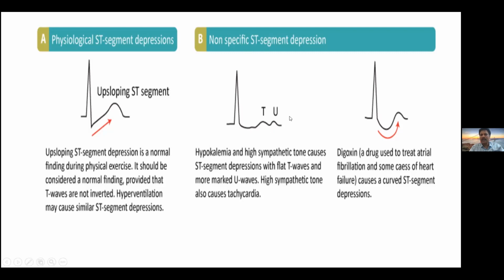This will be like a hypokalemia. Whereas in digoxin poisoning, you can see here there is an inverted tick mark appearance, digoxin overdose or digoxin digitalization. You will find this inverted tick. It is only pattern recognition. Just see this pattern, and if you see it in a patient who takes digoxin for a long time, then you see the digoxin pattern, that is inverted tick mark appearance.